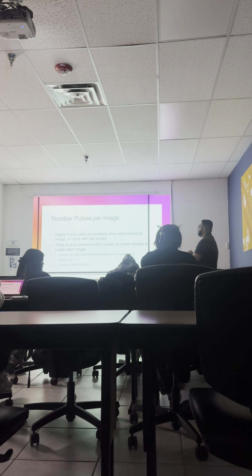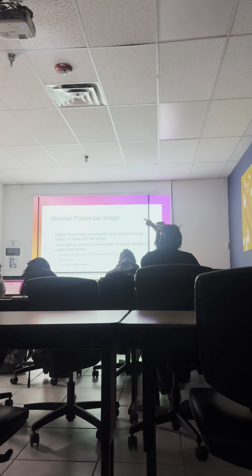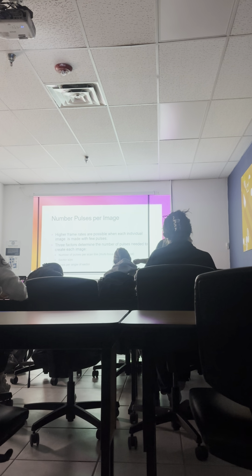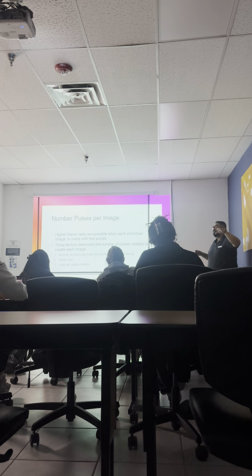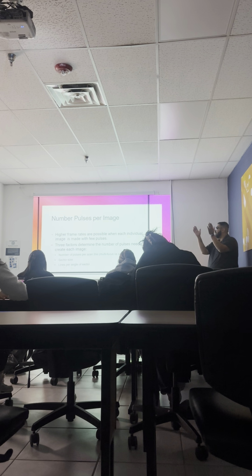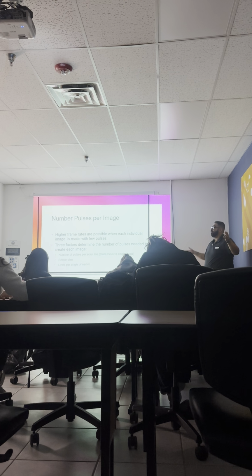Okay, and the lines per angle of sector. So on a curvilinear transducer, we have that whole array to work with, right? And each of those crystals sends out a scan line. So again, we could make our image smaller, that reduces the lines per angle, or we could make our image bigger and increase the lines per angle of sector.